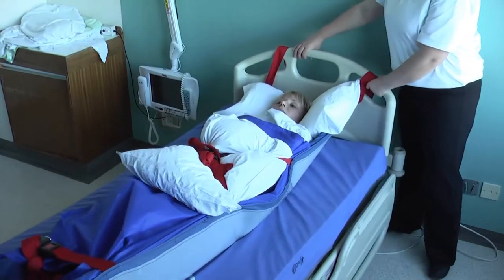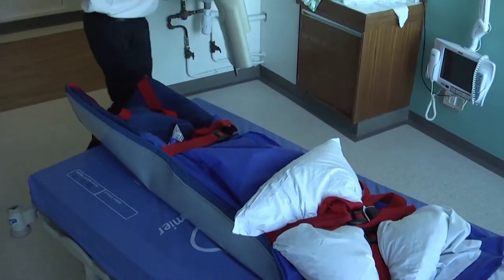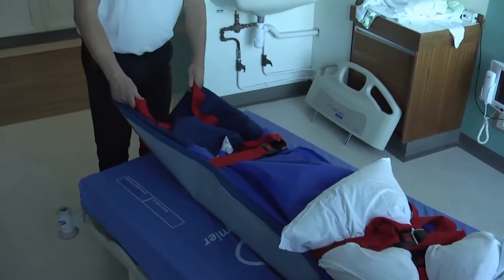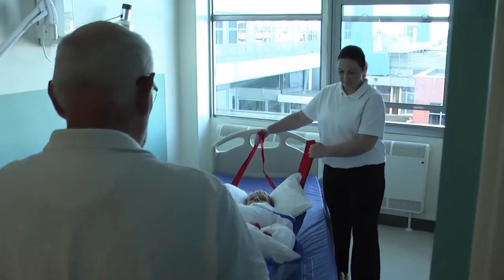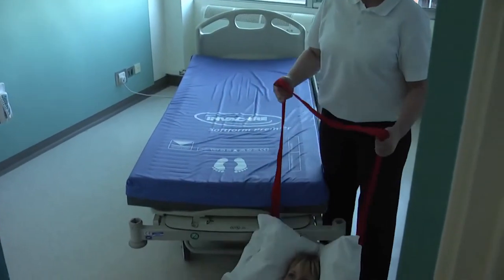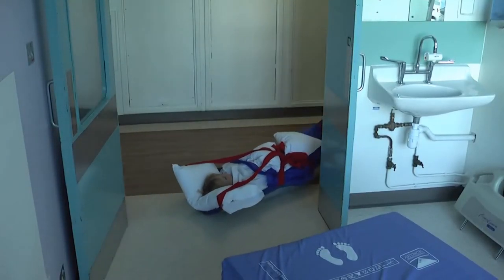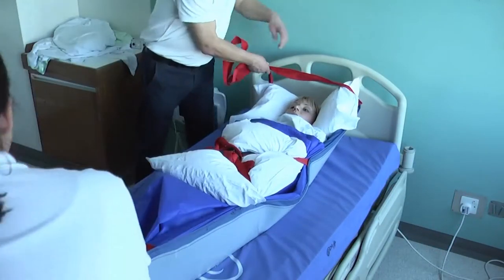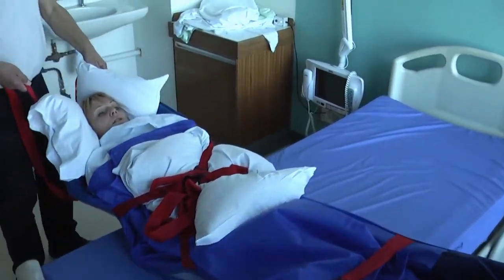The straps need to be tight but comfortable for the user. To prevent tripping, ensure the loose strap ends are tucked in under straps or placed in the foot pocket. Various methods of taking the user off the bed can be used; please consult your moving and handling department to ascertain the correct method of transfer for your own specific environment. If space allows, the bed can be repositioned and the user taken off the foot end of the bed, ensuring to protect their head throughout.